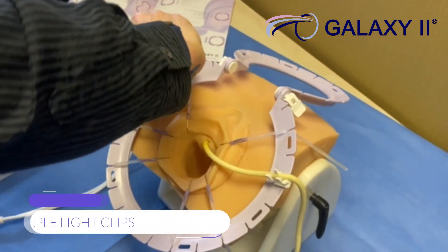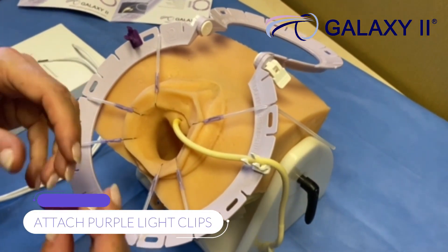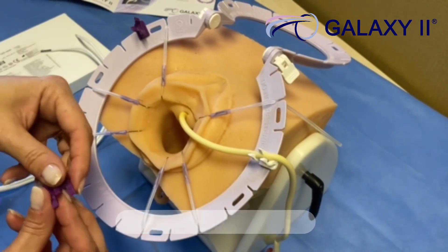Now, attach your purple light clips, placing them where you see necessary.